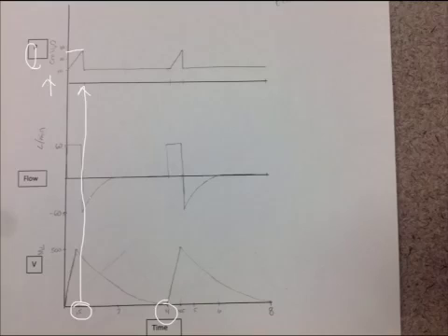When we went to the flow waveform, again, we labeled peak flow at 60 liters a minute in that square waveform, and she made sure to label the units there also. On our volume waveform, again, we had that linear volume waveform. We have a volume there of 500, so it goes up to 500, and those are correctly labeled.